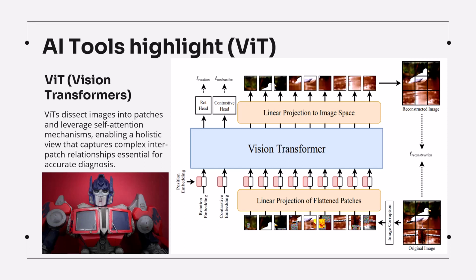Transformers use positional encoding and attention, and they also use something called self-attention. This makes them successful when trained on large amounts of data, and in retrospect they handle large data better. In our specific study here, we use a type of transformers, which is called vision transformers.